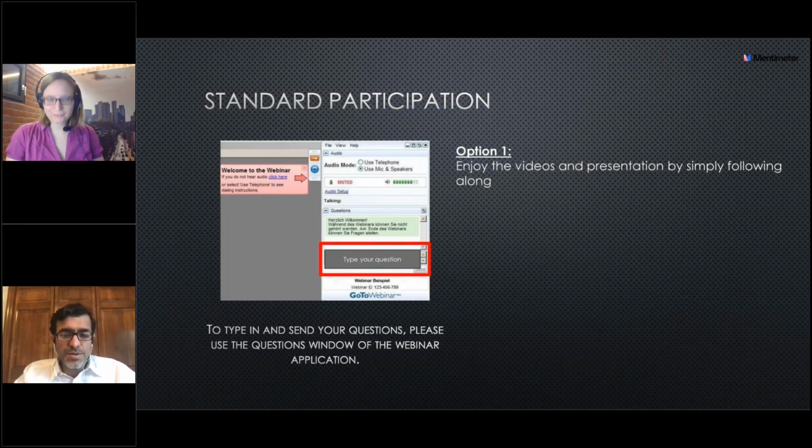And the case which I showed, my first case, which clearly was a subfoveal leak, the patient came back after 2 years with the fluid, and you know that the fluid is limited, you really don't need an FA. You can always just go ahead and do an extra laser with the 5% duty cycle, because we are pretty confident that it is not going to cause any structural damage. But you could not do this with PDT. In fact, in PDT, whenever we do it, we are always afraid of associated RPE atrophy, which usually happens in the long term.